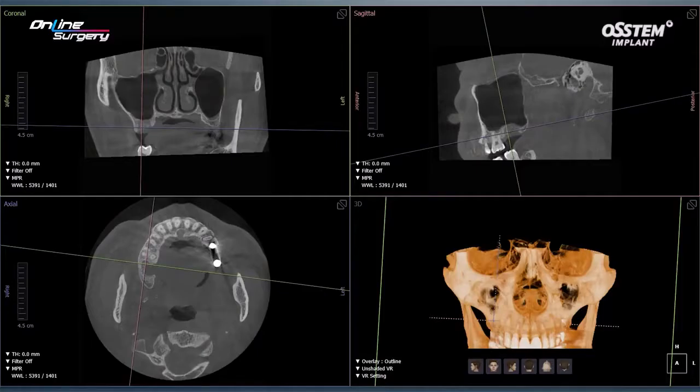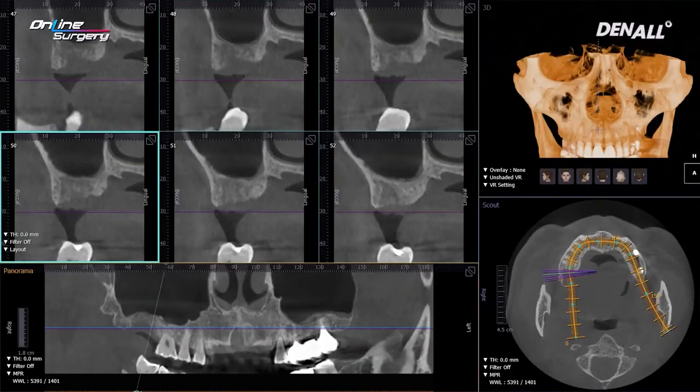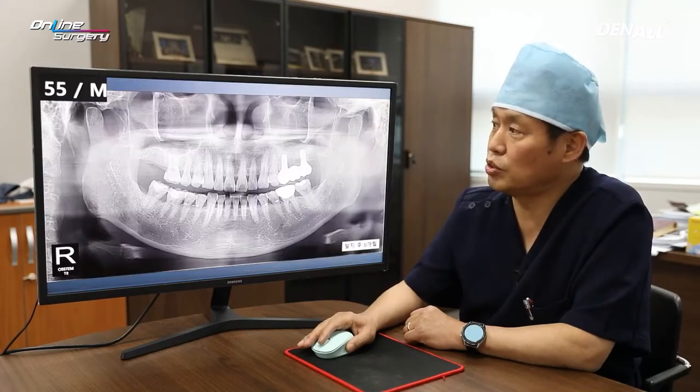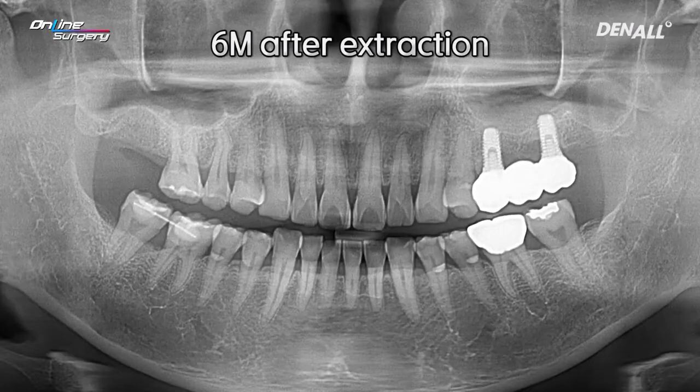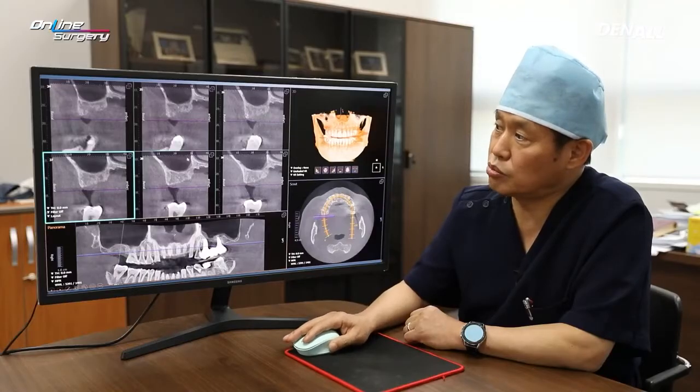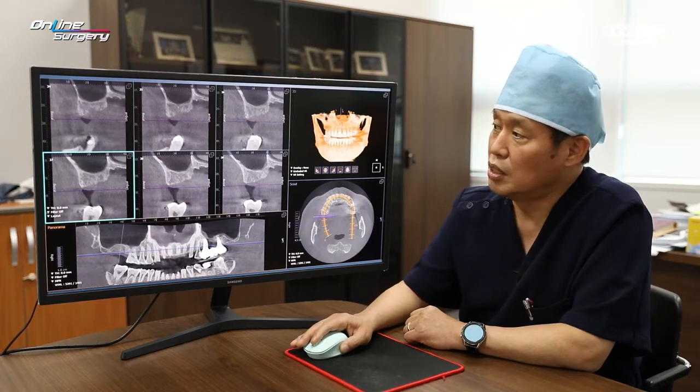Looking at CT, on the palatal side the bone healing is still insufficient. In the sectional view, the bone itself is not fully healed, so I decided to wait more. At six months since extraction, the extraction socket has healed significantly. On CT, the palatal side is not fully healed, but alveolar bone looks much more dense and bone regeneration is done nicely. Therefore, we decided to proceed with surgery.